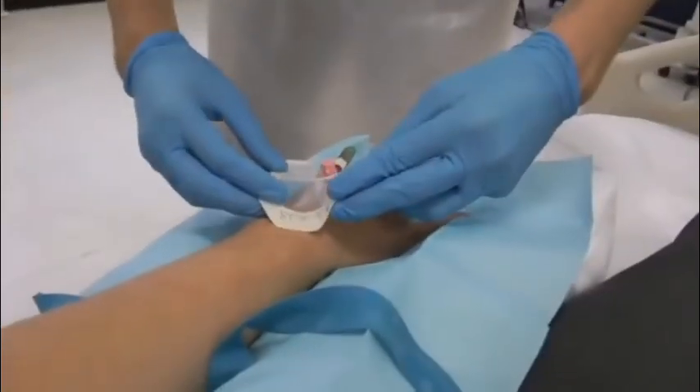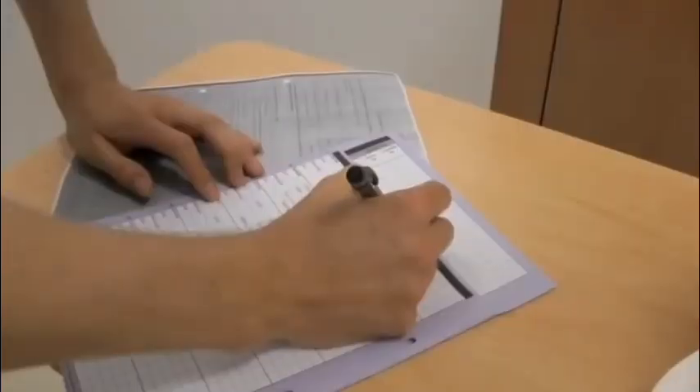Flush. Secure and apply dressing. Complete with date and document.